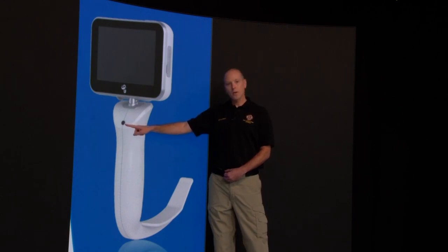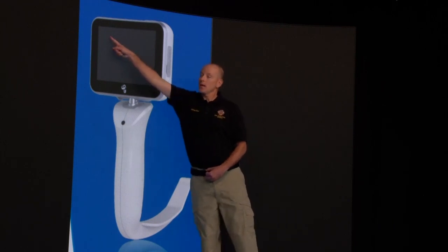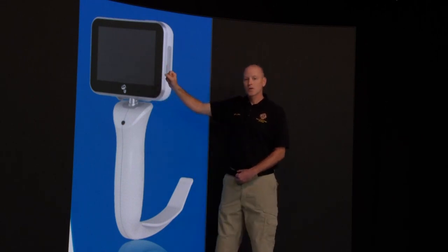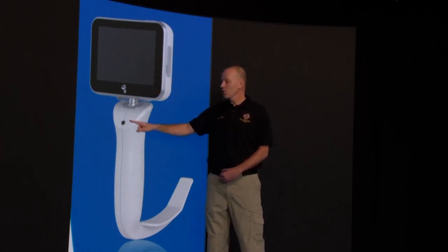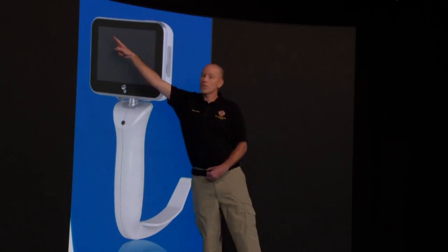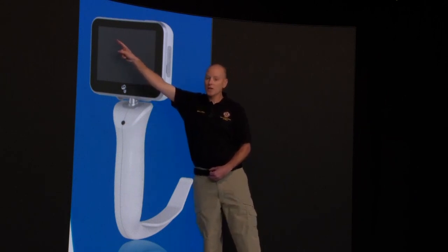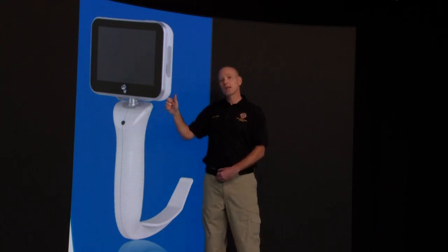The little black button on all of the single one-time use blades is where you're going to be recording. A simple push of the black button once, you have a still shot picture. If you hold it down, it's going to start recording, and you're going to see a red indicator that's flashing that's telling you it's currently recording. Until we attach videos to the PCR, if you hold the button down for approximately 2 seconds and you notice a red flashing indicator saying that you're doing a video, you need to double click so you can then get your single picture to attach to your PCR.